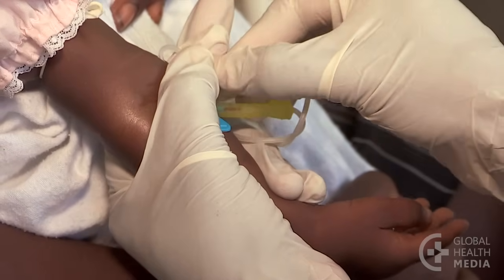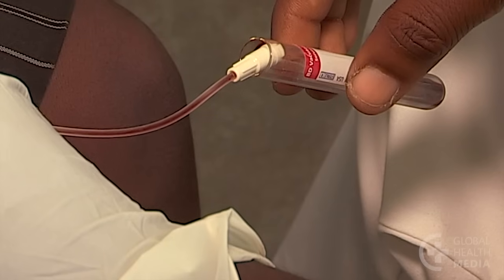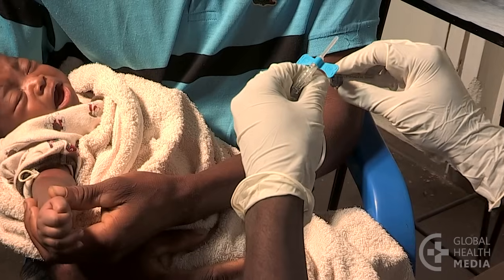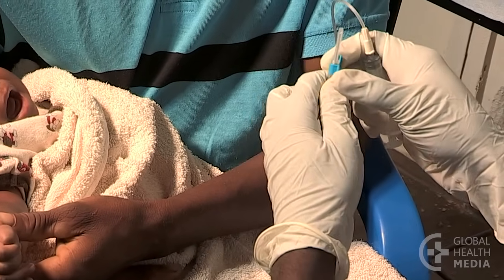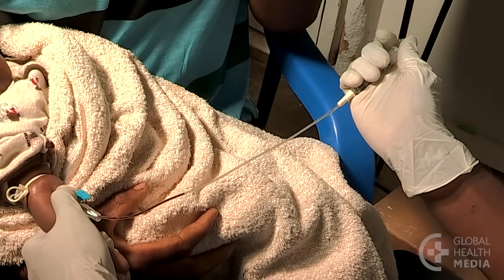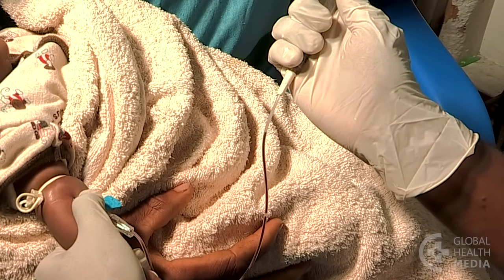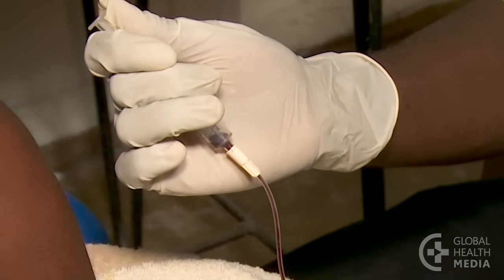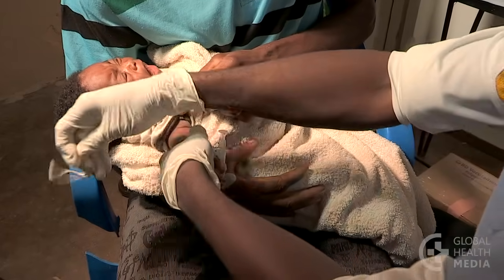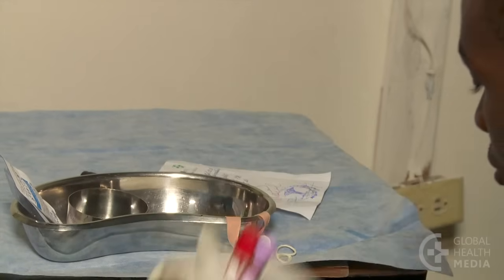Uncap the end of the device to draw the blood into the tubing — it then drips into the tube. In a second example, a syringe is attached to the tubing; pulling up slightly on the syringe draws the blood into the tubing. Be aware: if it flows too slowly, it can clot. Let it fill the syringe until you have the amount of blood you need. Release the tourniquet, remove the needle, cover the site with a cotton ball, then safely dispose of the butterfly device.